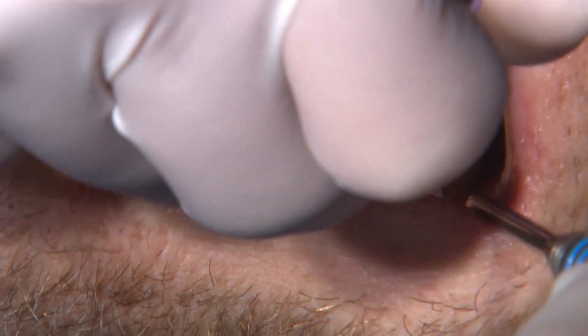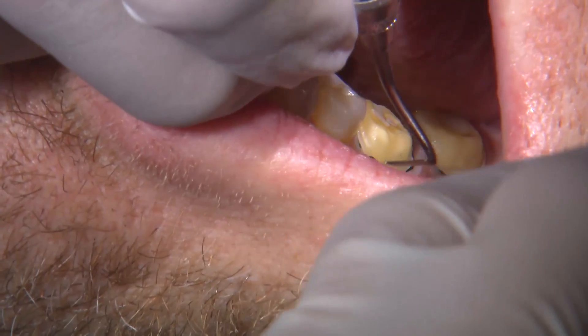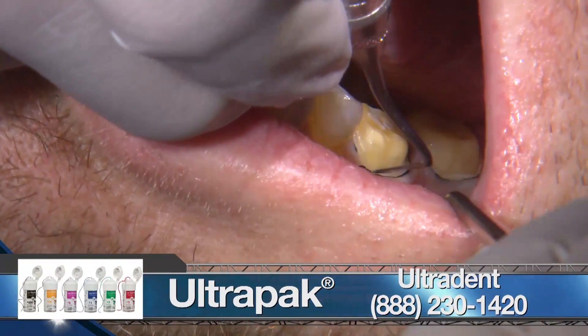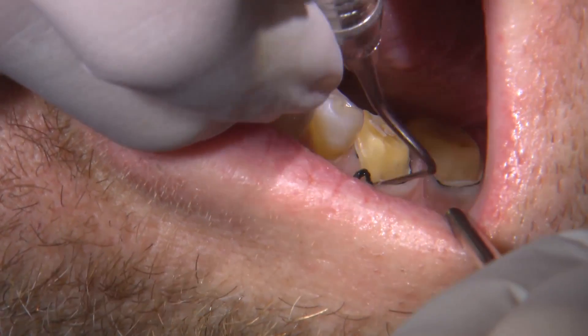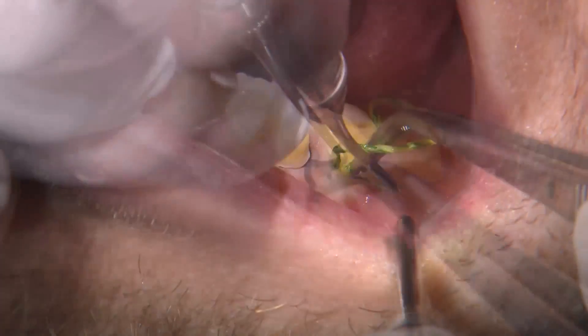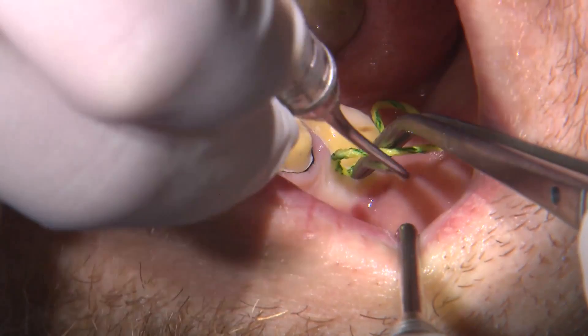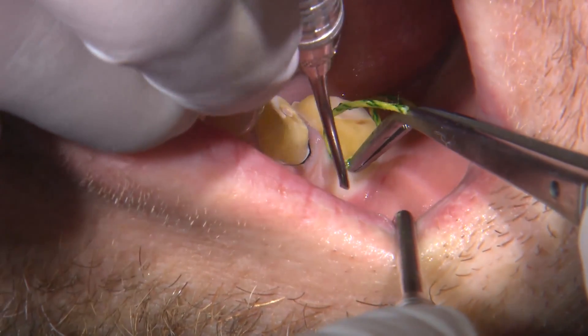A very important step that should never be overlooked is gingival retraction. Here I'm using a double cord technique. The first layer is a thinner double zero, and that will help displace the gingiva apically. A second layer of cord is applied right on top of that to help displace the tissue laterally.